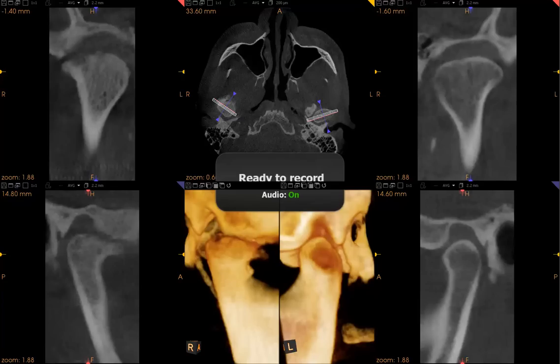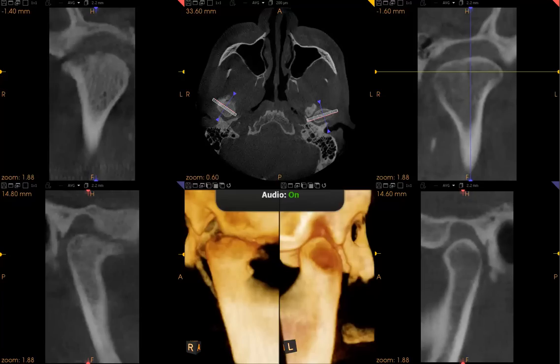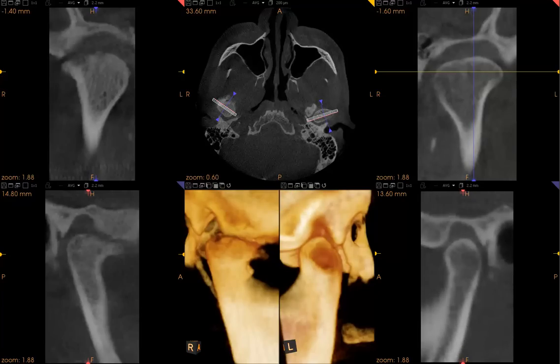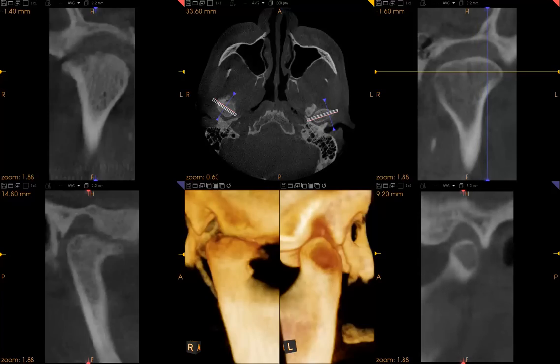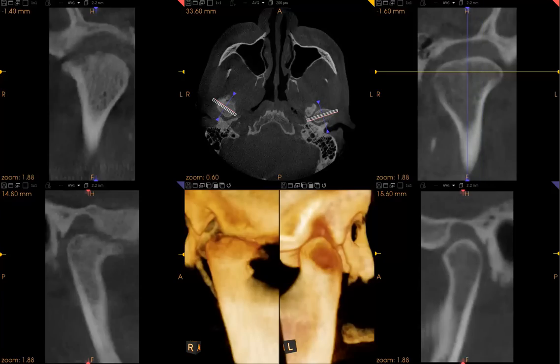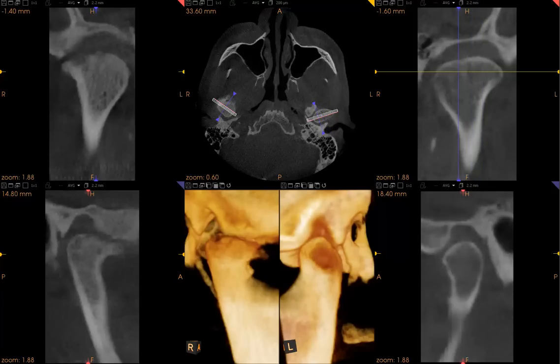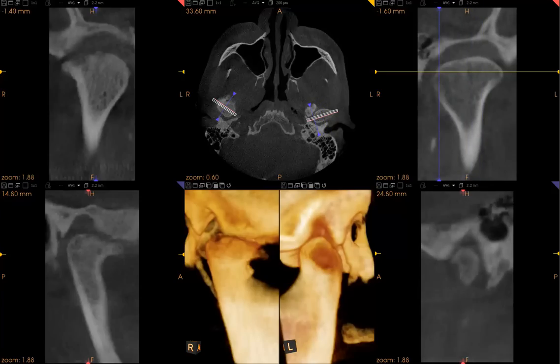In this temporomandibular joint scan, we can see the patient's left joint is relatively normal. As we progress from the center of the joint towards the lateral pole, we can see the cortex is relatively normal. And as we go towards the medial pole, we can also see that there's a nice cortex and a nice contour to the left joint.